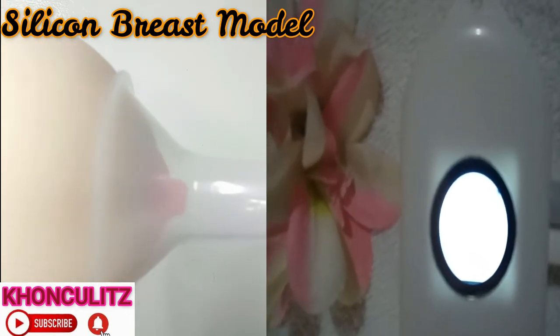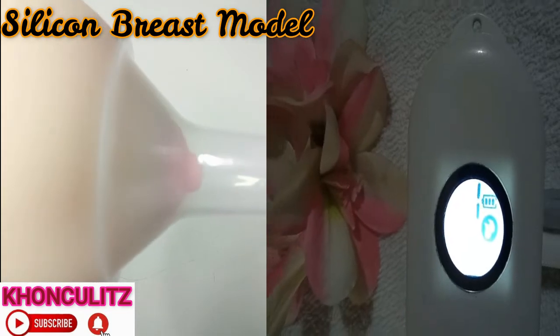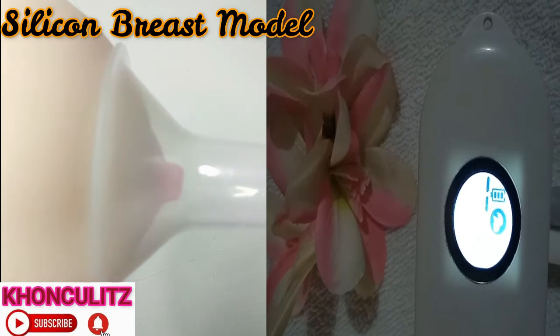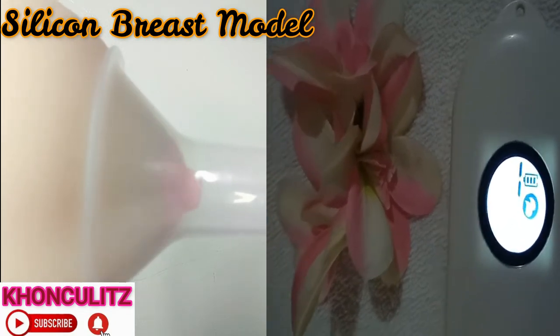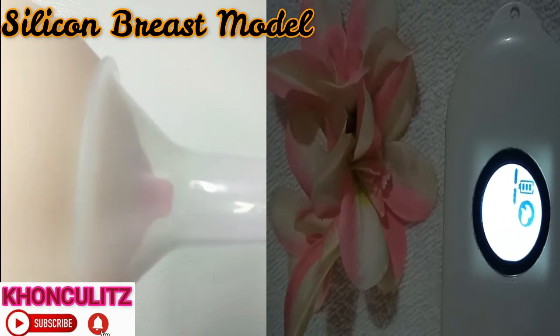That is expression mode number one. So you can see here what they mean when they say Wise Mom Pocket has strong suction — that's the proof. This is expression mode number one.